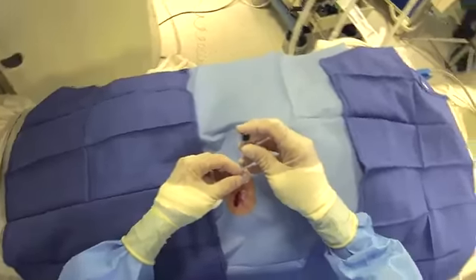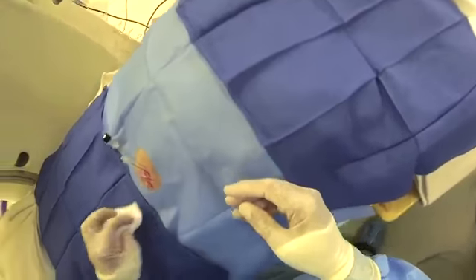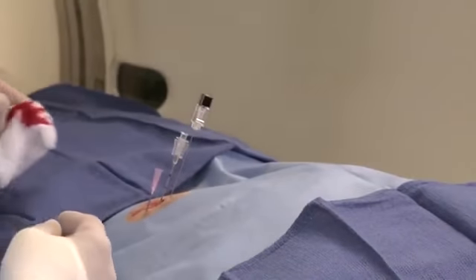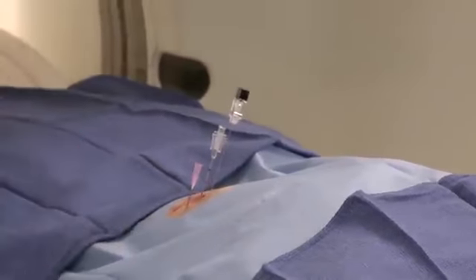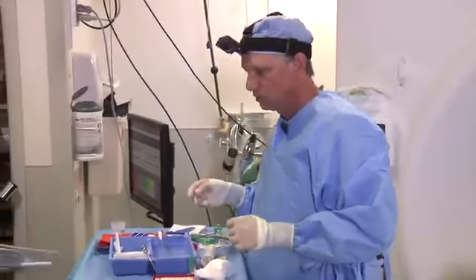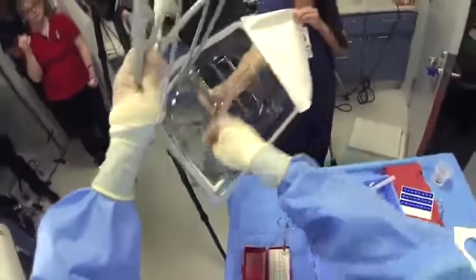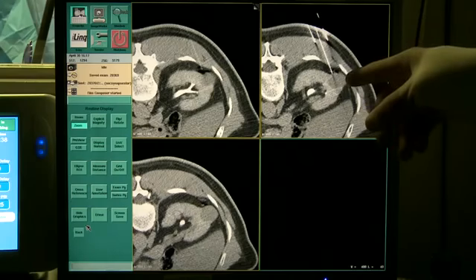We'll repeat our 3 images. Those 3 images, of course, are one at, one above, and one below, a typical so-called Z formatting of the CT manufacturer. So we'll get our second probe out here and get it up and running. So our marker needles are in place along with the guide needle.